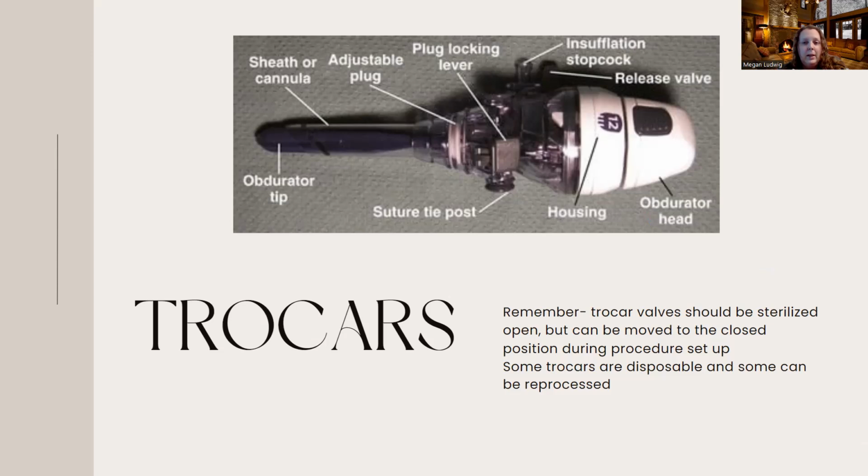So if I get one as a surge tech on my field that was sterilized closed, I have to get rid of it. It can't be used. That means the sterilant didn't go through that trocar completely. So always watch for that. Okay. That's very important. So if you are the surge tech and are now setting up for this case, you check for that. If it was sterilized open like it should be, I go ahead and then close it at that point. Okay. I like to put them up on my Mayo stand in a closed position for that surgeon.